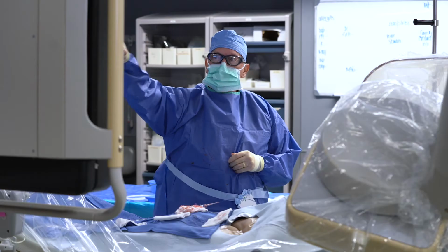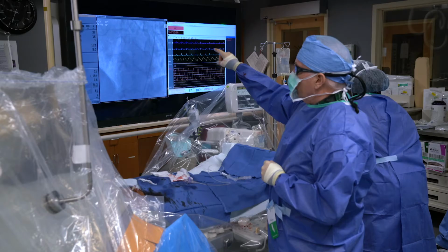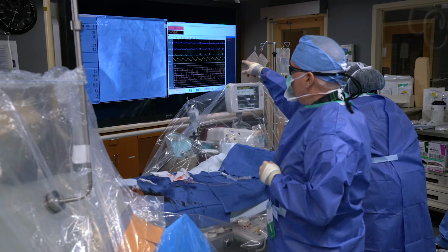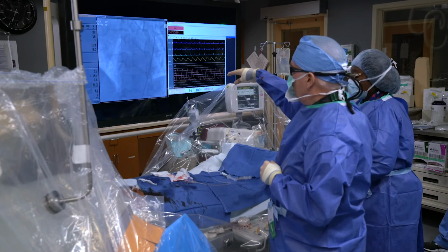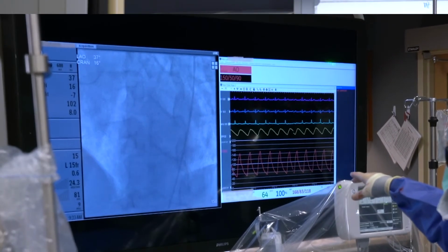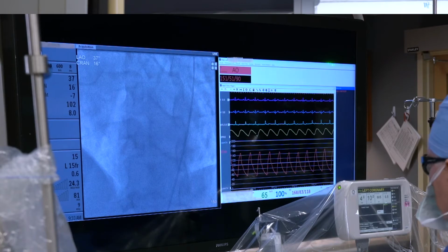of the artery. Our screen here provides very important information, and the three most important things that we see here, four of them actually, are the images of the patient's heart. It gives us the EKG pattern of the patient's heartbeat. It shows us their oxygenation levels and how well the blood is oxygenated. And then it provides us an invasive evaluation of the patient's blood pressure. So that's the aortic blood pressure that we see in the red screen.